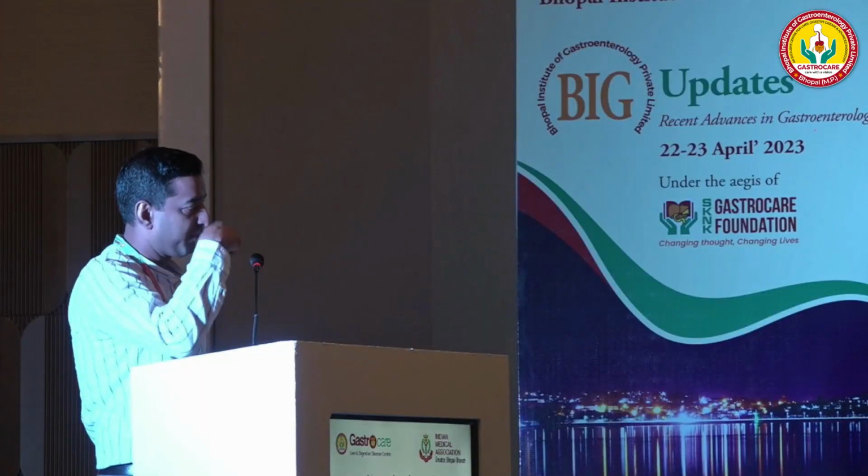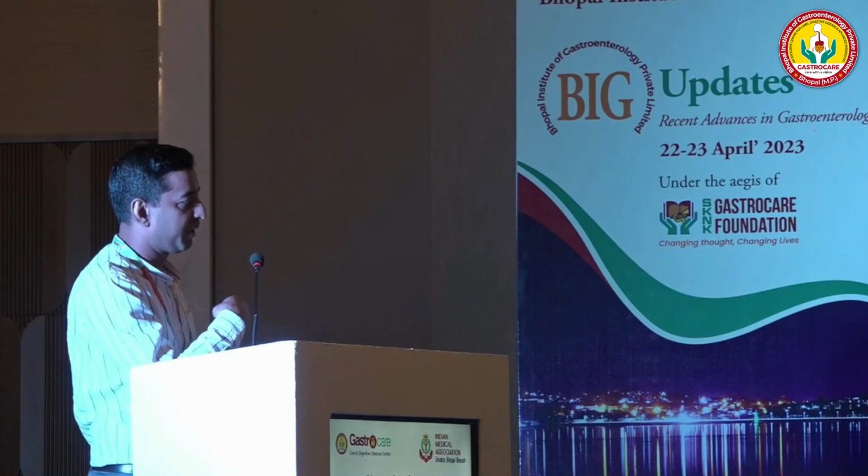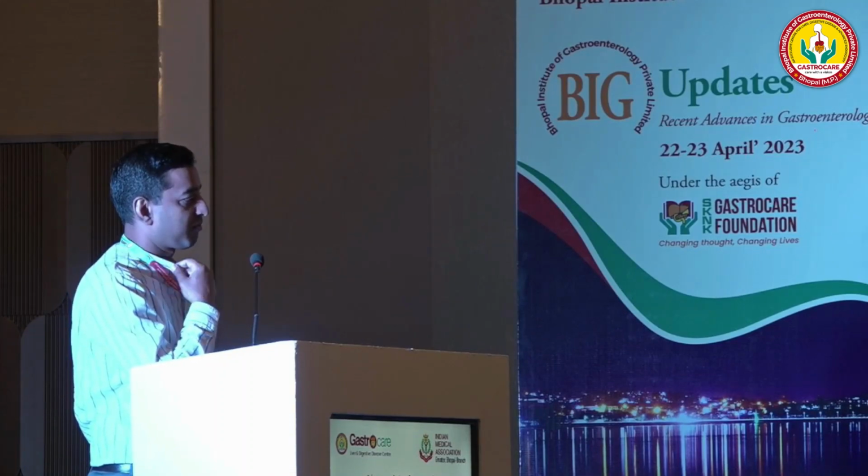Recently, TIPS is also tried for portal vein thrombosis. We can put a TIPS stent, and we can aspirate the thrombus and do thrombolysis through the TIPS. That we have not done in our institute till now. Maybe in future.